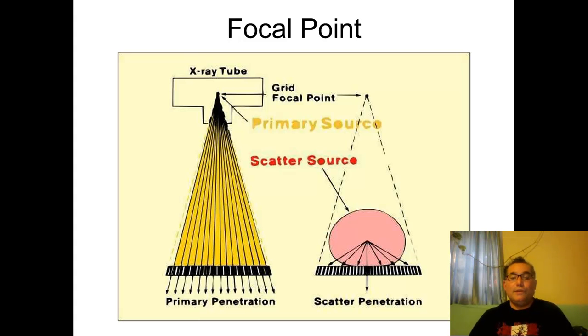Another term I want to point out to you, when we talk about this focal distance, it's kind of like SID. The point that we are actually measuring is from the tube, from the source, or what's known as the focal point, to the image receptor, right down here.